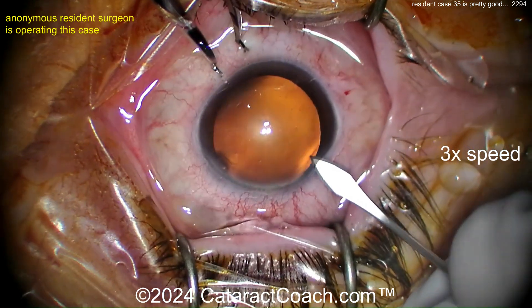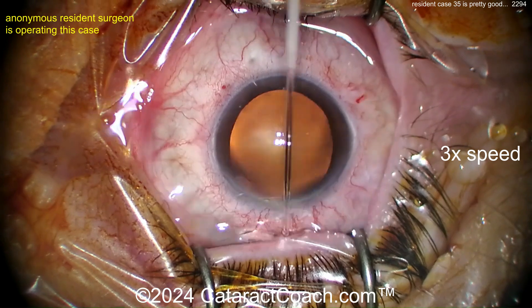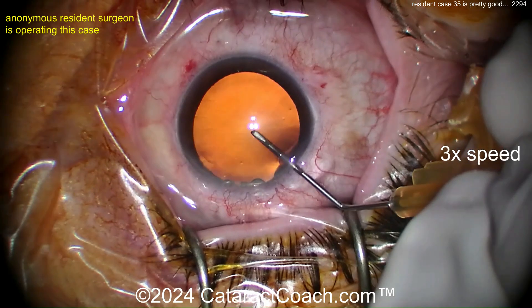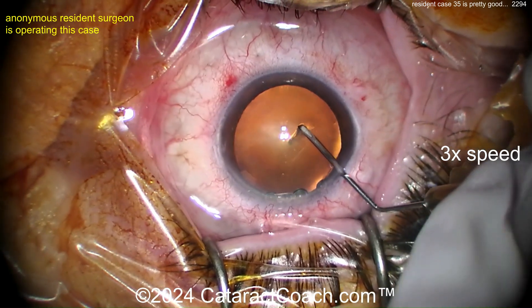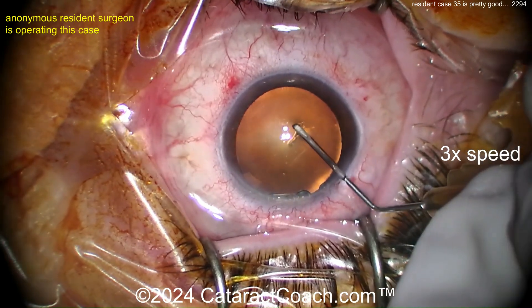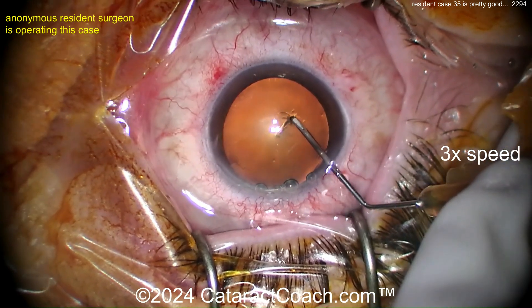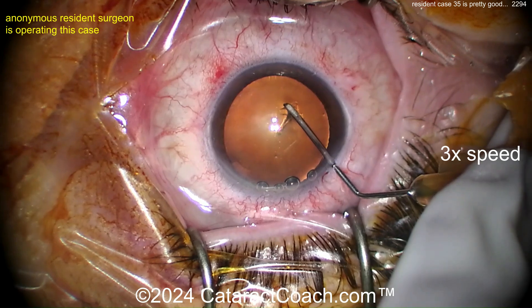The incisions are good — 90 degrees apart, I like that — barely nicking the limbal vessels, that looks pretty good. Now poking in here with the cystitome. Rexus is done. Look at that big red spot on the limbal area where you grabbed with the forceps; you want to learn to avoid doing that.